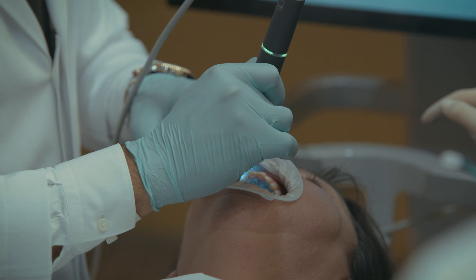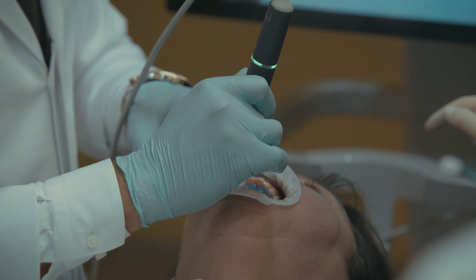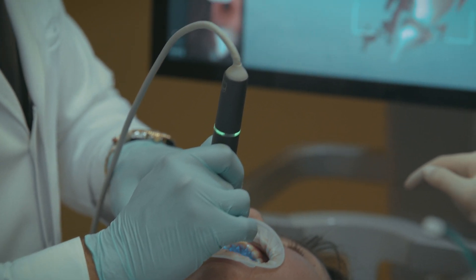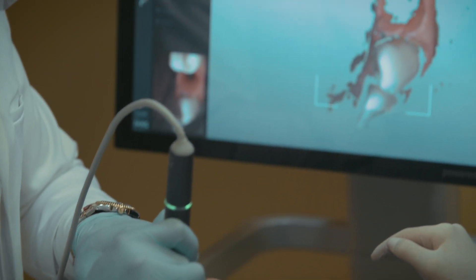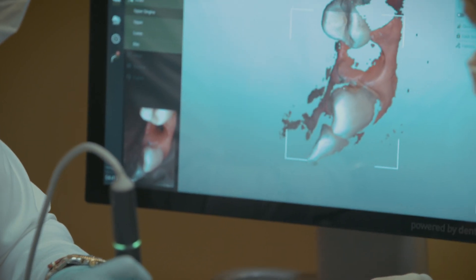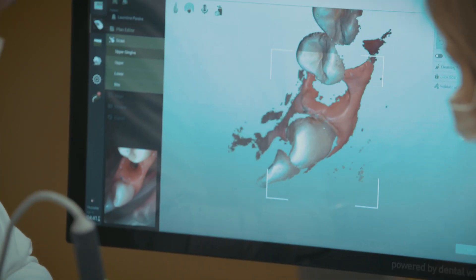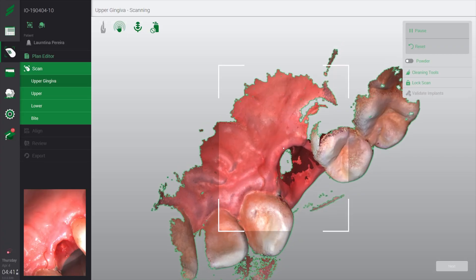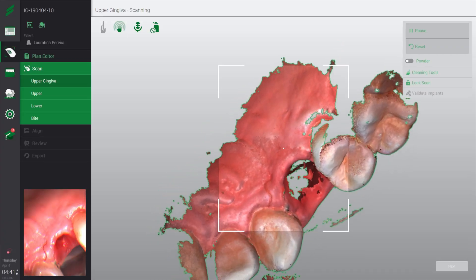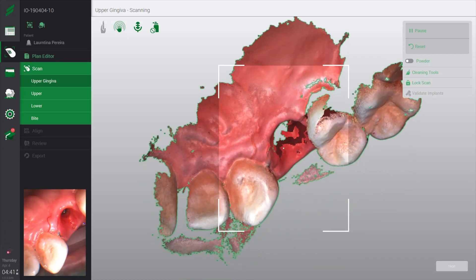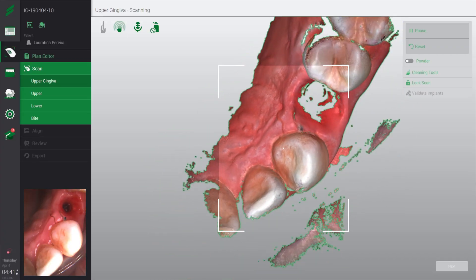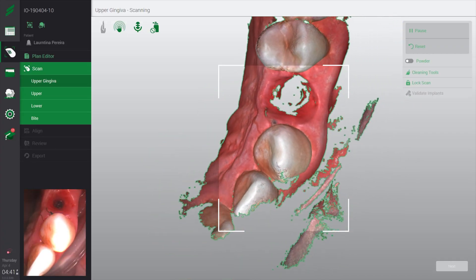Digital scanning devices are rapidly developing in many fields of dentistry. Thanks to the milling machine, we can close the gap on our digital workflow and provide the final restoration to the patient the same day. So let's see how we can achieve this.